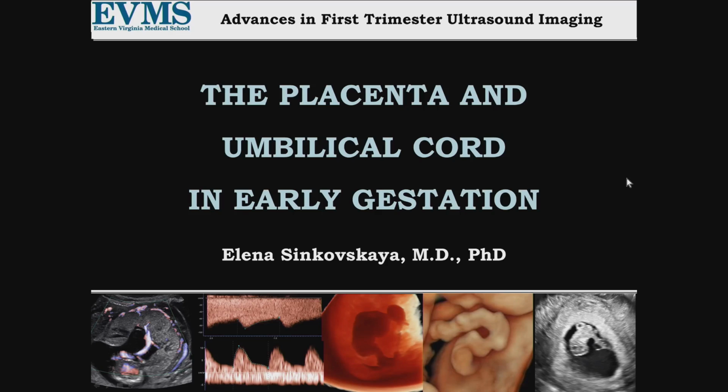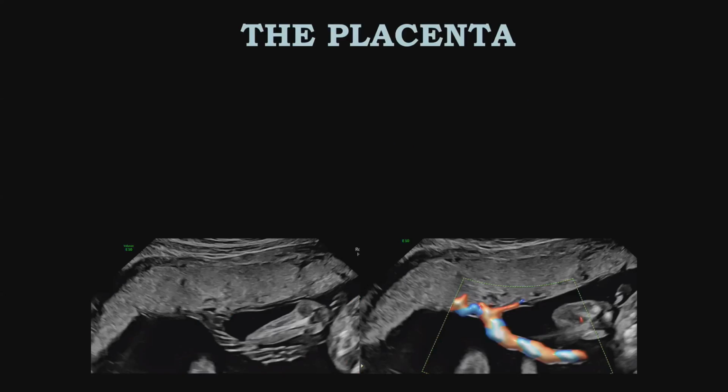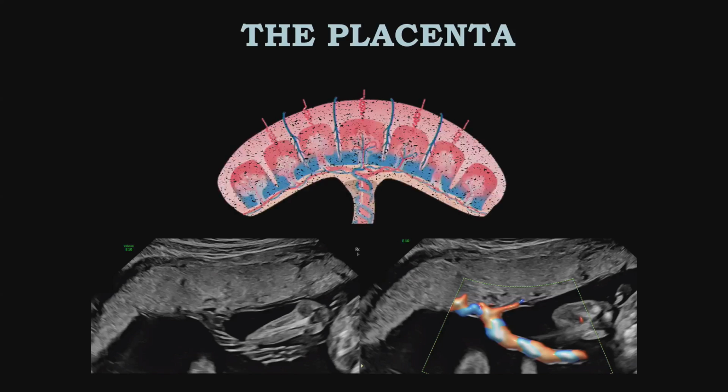Then we are looking at the pregnancy. And I think that the placenta, this forgotten organ, fortunately lately got a lot of attention from researchers and practitioners. And I would like to share with you our experience in the evaluation of the placenta and highlight the new emerging ultrasound method that allows us to look deep inside into details of the placental function and the evaluation of the placental structure.